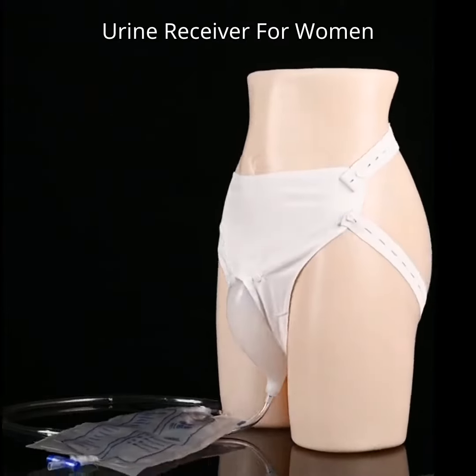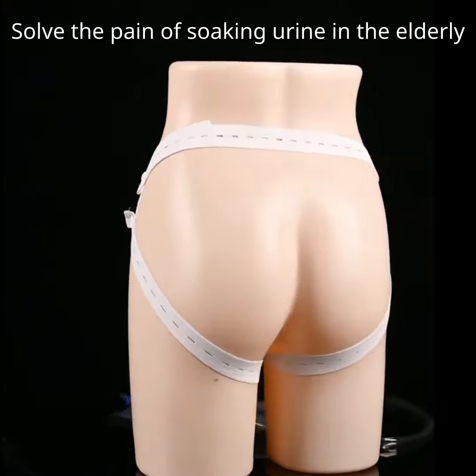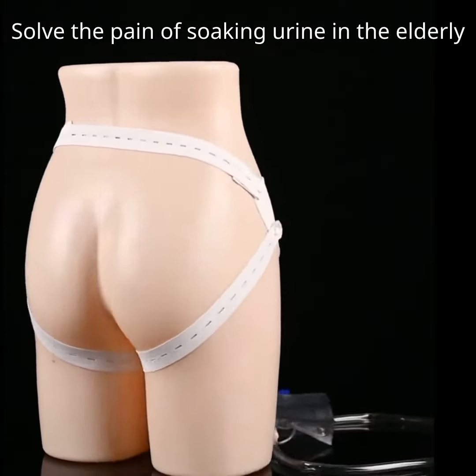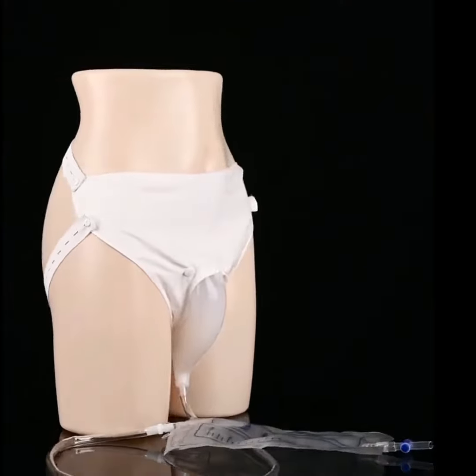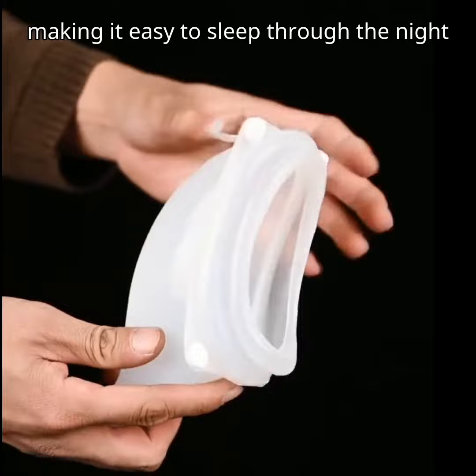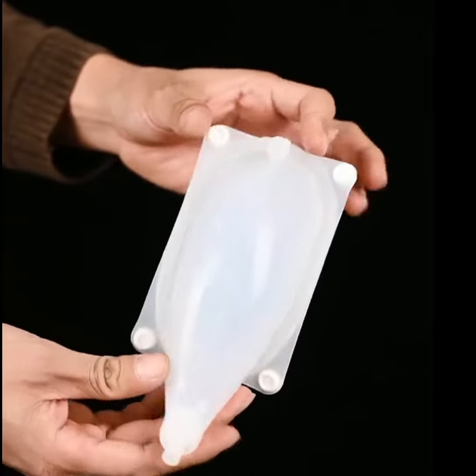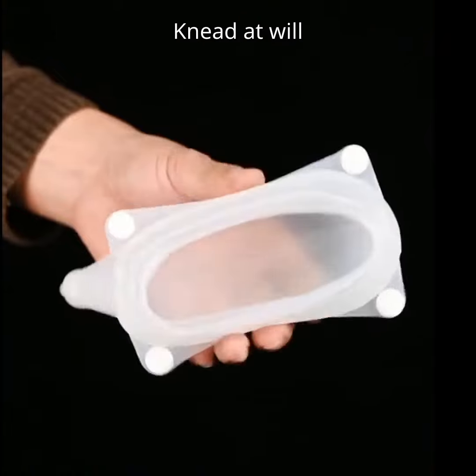Medical silicone urinal urine receiver for women. Solves the pain of soaking urine in the elderly. Prevents leakage while lying down, making it easy to sleep through the night. High purity silica gel for medical use, bend at will.